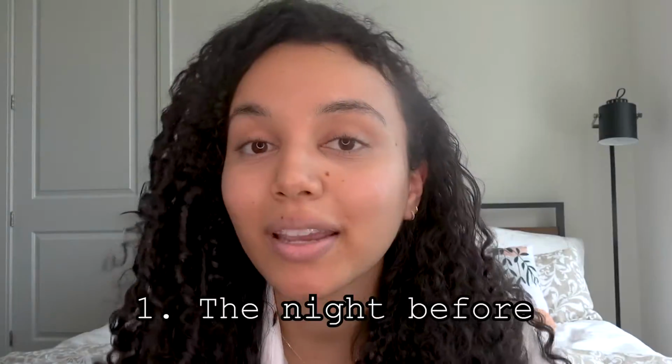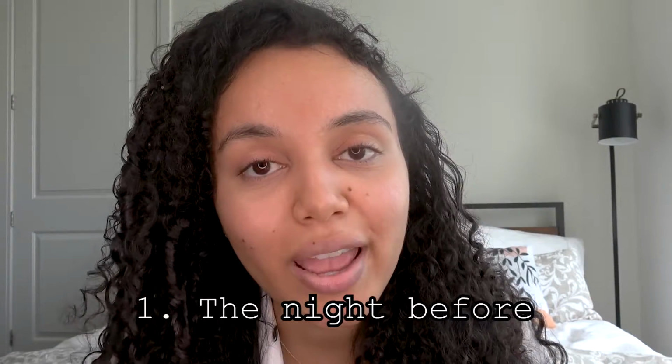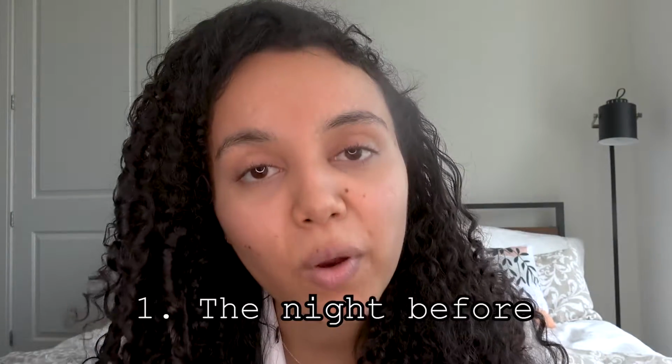Tip number 1, when it comes time to go on to the next tray, put it in the night before. I find that the peak of soreness is just after you put in a new tray, but if you put it in at night, you get to sleep through some of that pain and you get to wake up feeling a little less sore than usual. If you put it in first thing in the morning, you have to live through that entire day of pain.